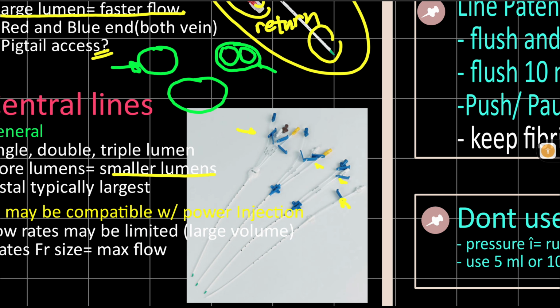For the multiple lumen, you will normally see here 2 small and 1 large. Okay, so if you're gonna think about it, having this knowledge, if you have a multiple lumen, you want to put the highest volume of fluid that you want to give to your patient.